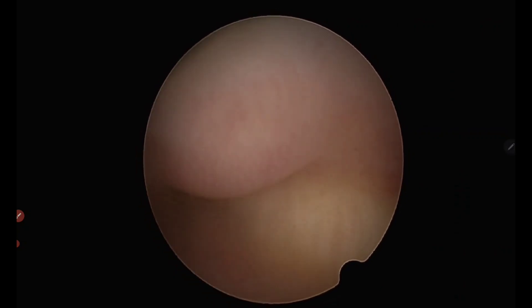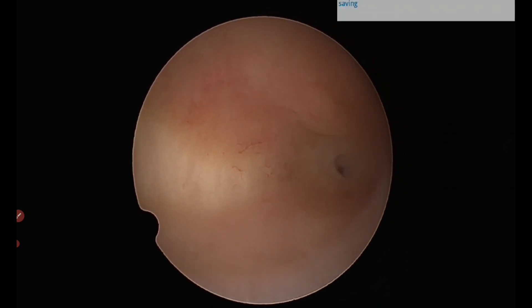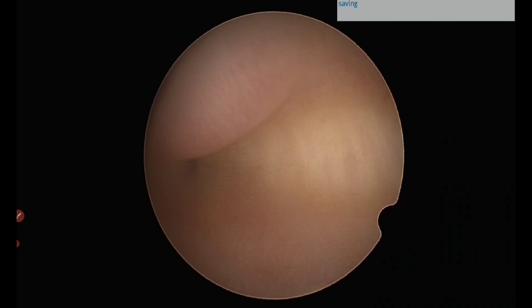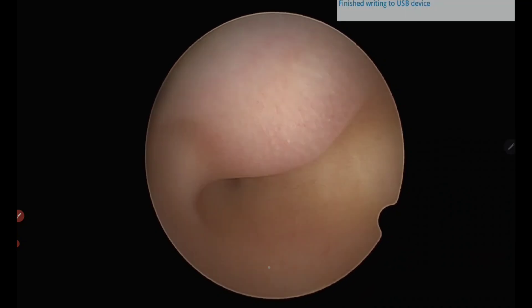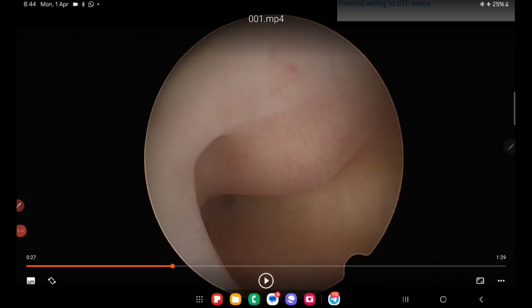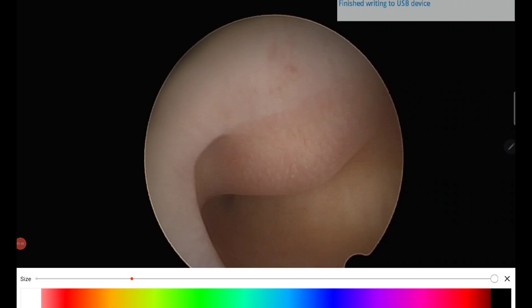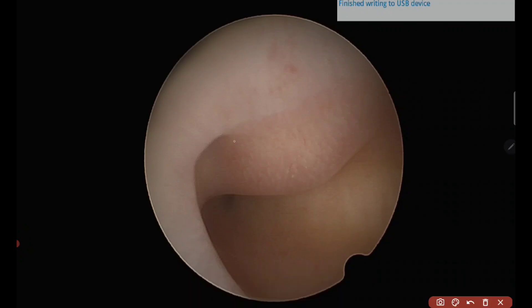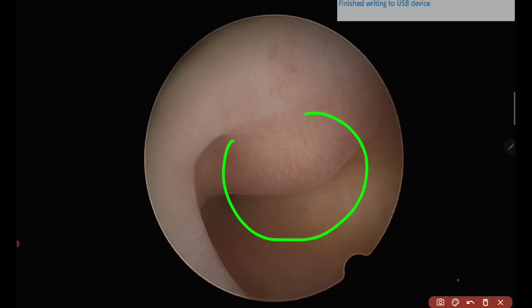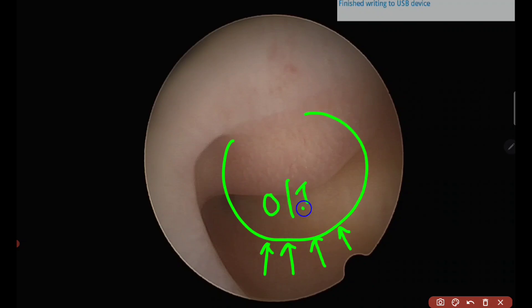The procedure starts and the hysteroscope enters the uterine cavity. You can clearly see a bulge of the fibroid on the right lateral wall, with no similar bulge on the left side, and there is a small polyp. The ultrasound reported a type 0 to type 1 fibroid, but the pressure of the distending saline pushes the fibroid up into the myometrium, causing it to now appear as type 2 in actual surgery.